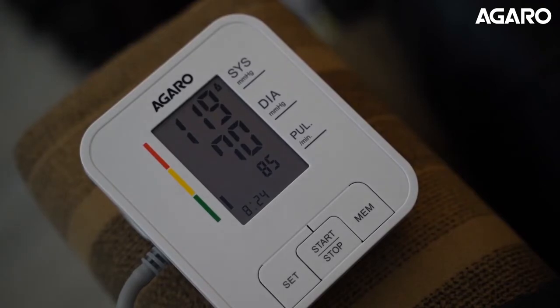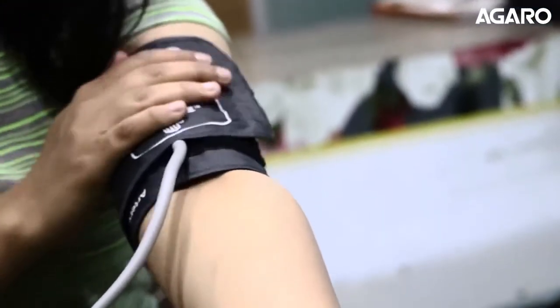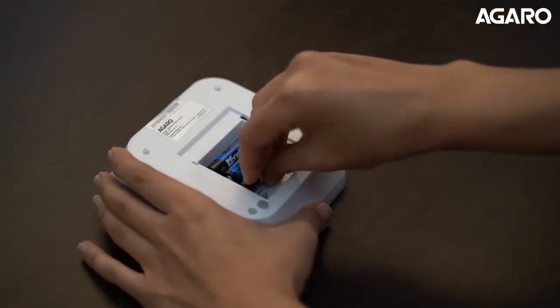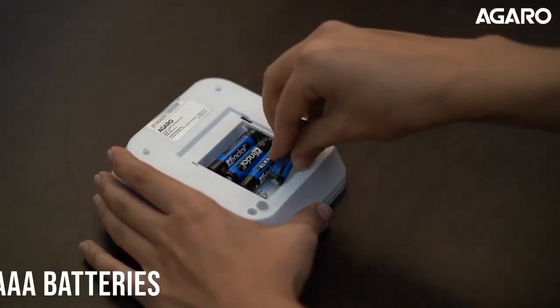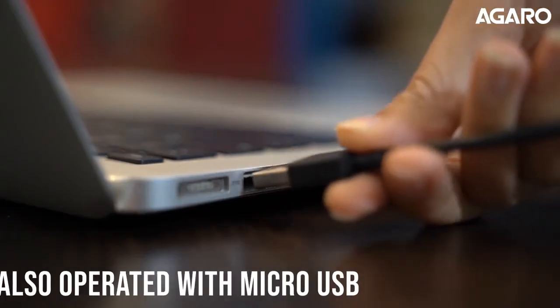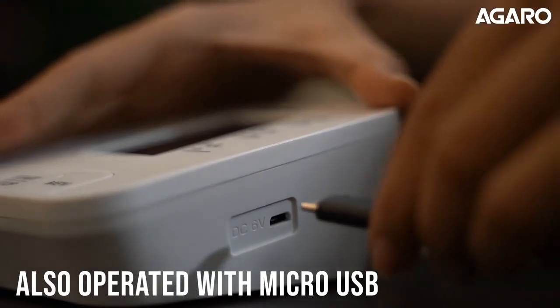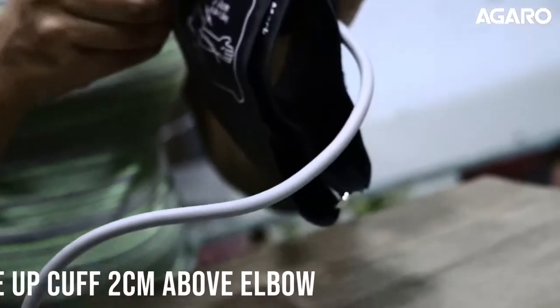The results are displayed on a clear LCD screen with a clear and attractive display. The BP monitor can be used either with four AAA batteries inserted in the slot at the back, or it can be connected to any power source with a standard micro USB cable.